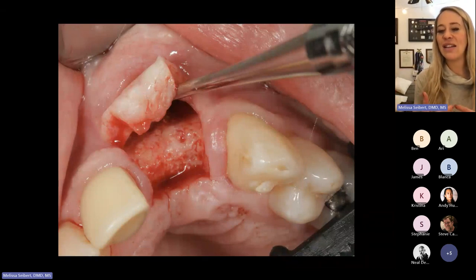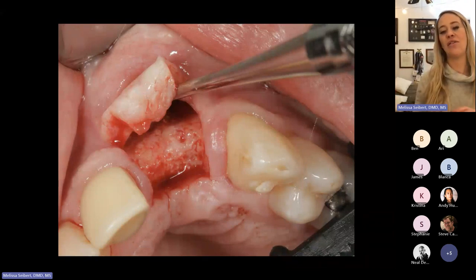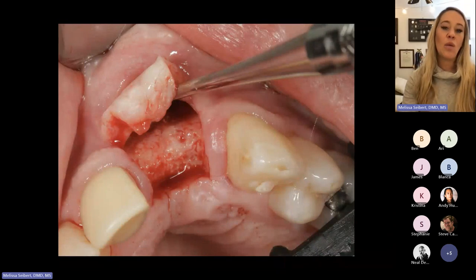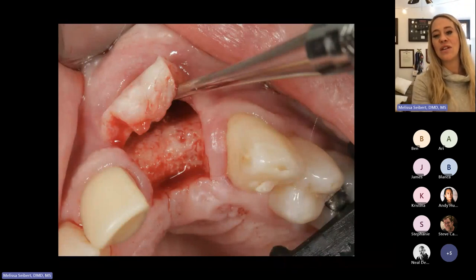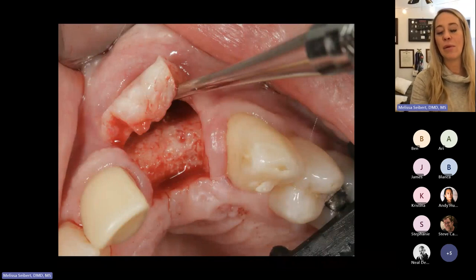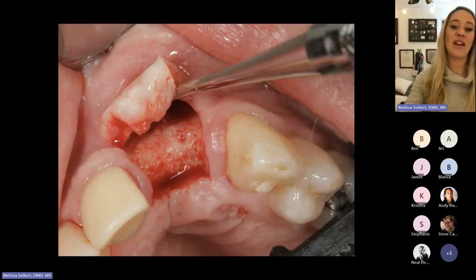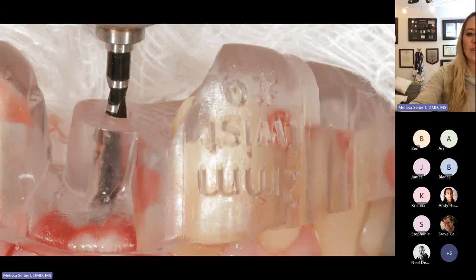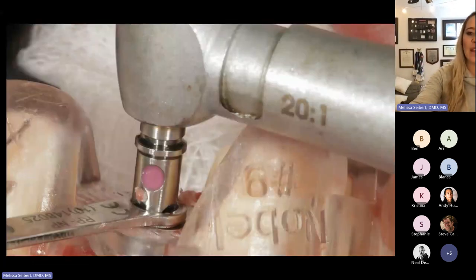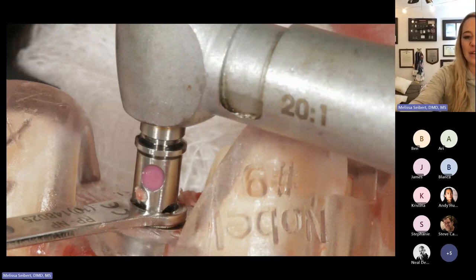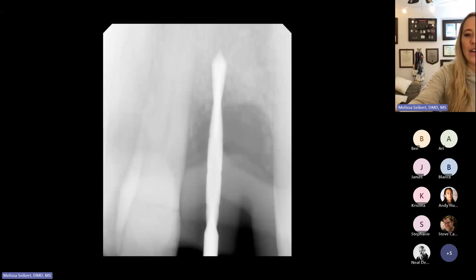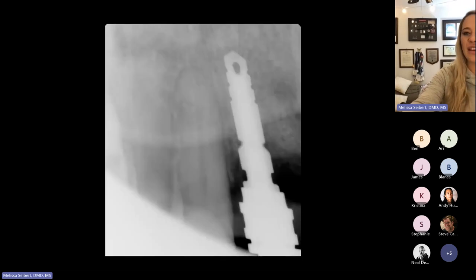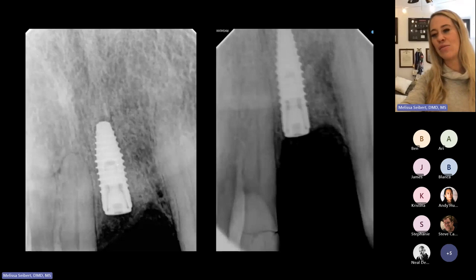Here's the flap for the actual surgery. Anyone who's placed a flap like this can appreciate that the flap might push up a little bit against the guide — because the way I design them, they're not completely covering the tooth, really only about half to two-thirds of the way. Sometimes the flap will push up. But because the first surgery's grafting was so precise, I did a bit of a papilla-preserving incision here, which made for a very smooth surgery. Here I'm first doing my two-millimeter twist drill — I designed that guide separately — and then here's my guide for the placement.